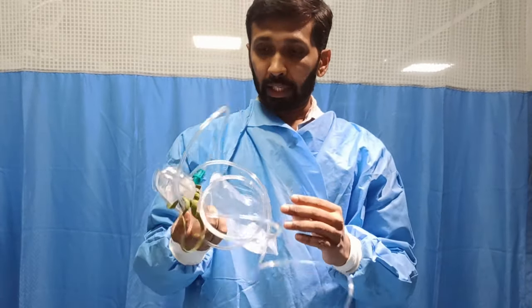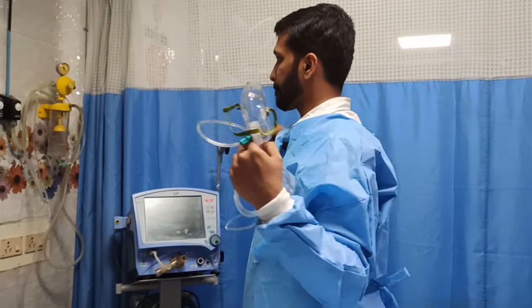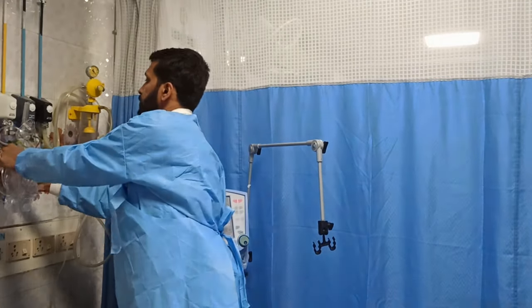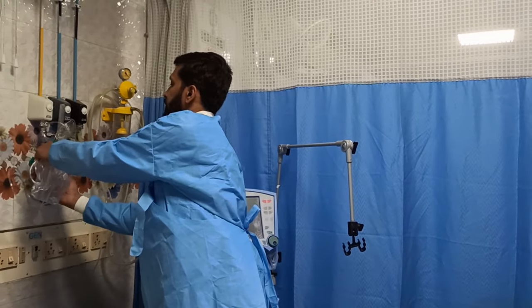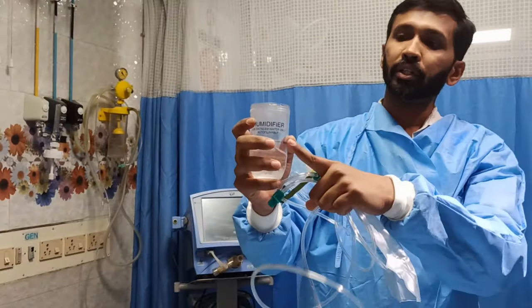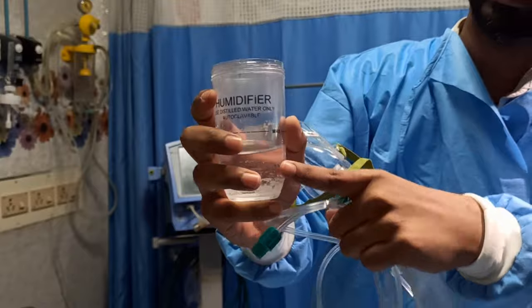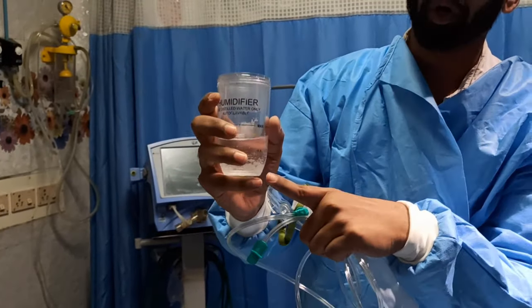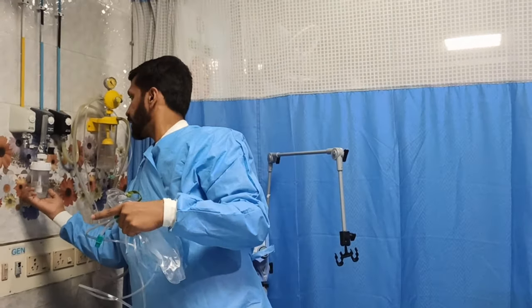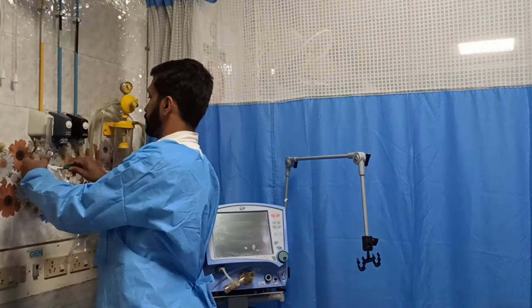So how to connect this NRBM to the oxygen flow meter, I will show you. This is a flow meter that you use here. The first and foremost thing we should be careful about is that the flow meter should be connected to a humidifier. That humidifier should have an adequate amount of sterile water to humidify the oxygen coming from the wall mount. Once you have enough sterile water in the humidifier, you connect the tube to the flow meter here.